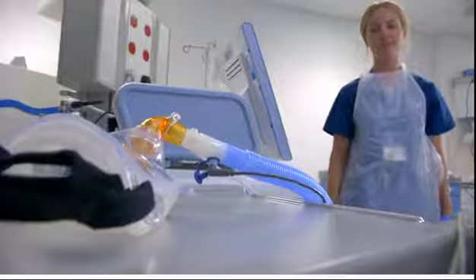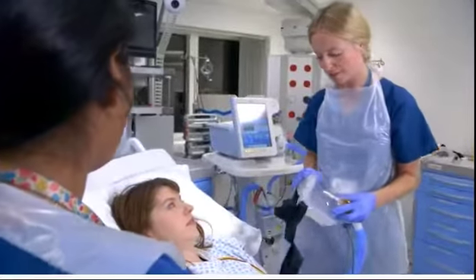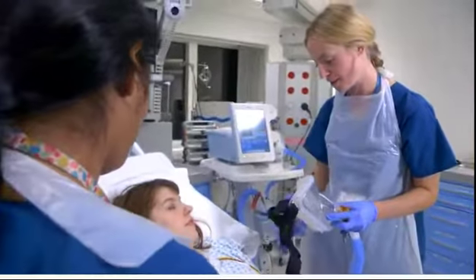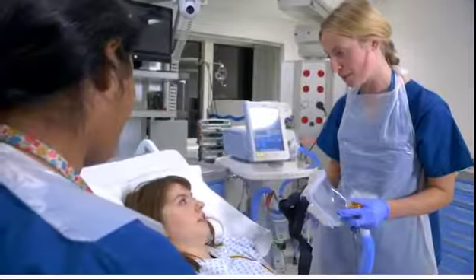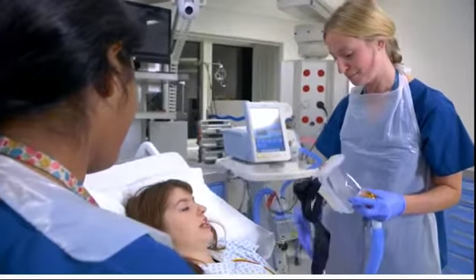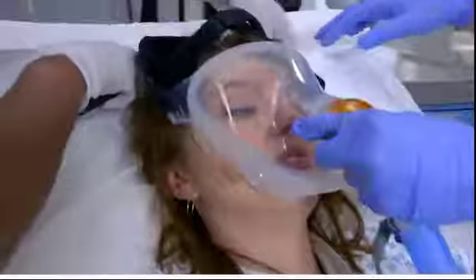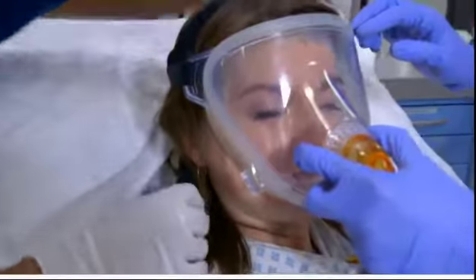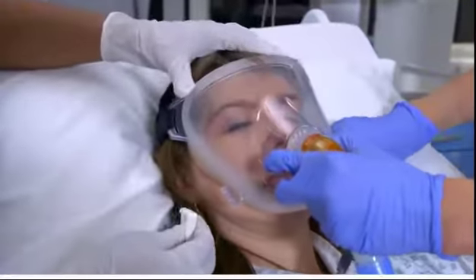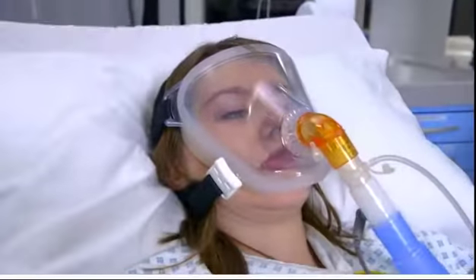Explain to the patient that you are going to fit the mask. The mask will have to be quite tight and held on by straps. This mask will be connected to the ventilator, which will help with their breathing. Explain to them that the mask may be uncomfortable at first. Once the mask is fitted, check the mask for any excessive leak and ensure the patient knows how to both take the mask off and call for help if needed. It is important to stay with the patient while they get used to being on the ventilator and ensure they are as comfortable as possible.